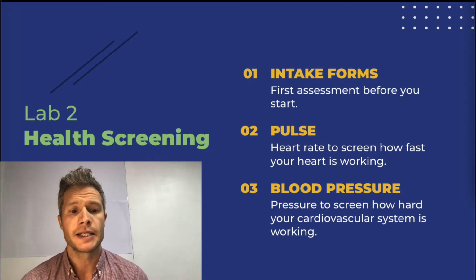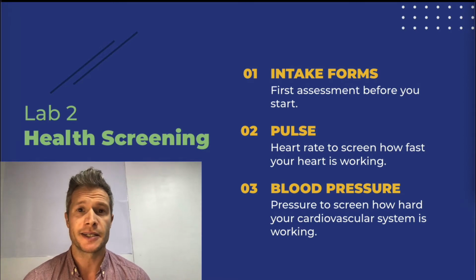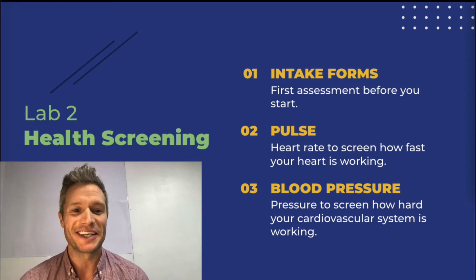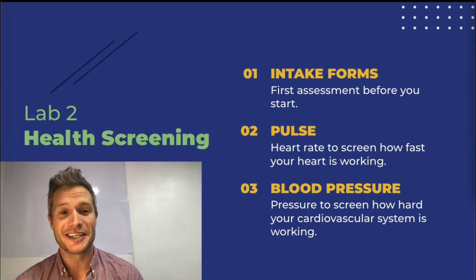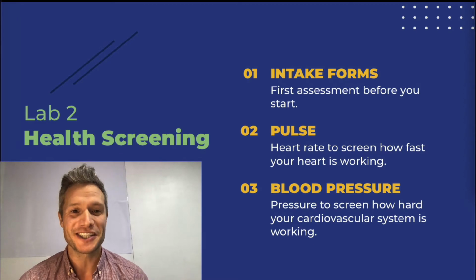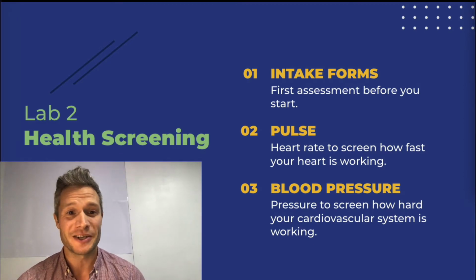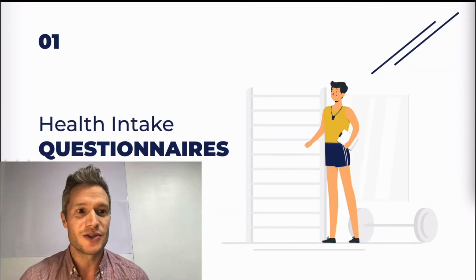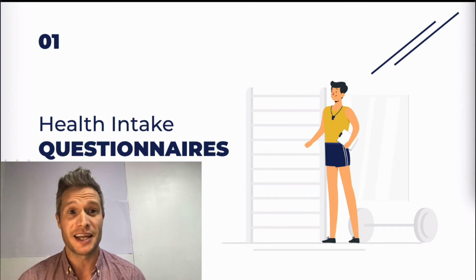Then we're going to take a look at pulse and how to take a pulse and what sort of information you can gather from that. Then we're going to get into taking people's blood pressure. And again, this is something that a lot of people find fun and kind of interesting. You see many people in the health profession do it, doctors, nurses, and kinesiologists, and learning how to do it and what it's all about and the information you can learn from taking someone's blood pressure is always interesting for a lot of people. So let's dive into the questionnaires or the intake forms.